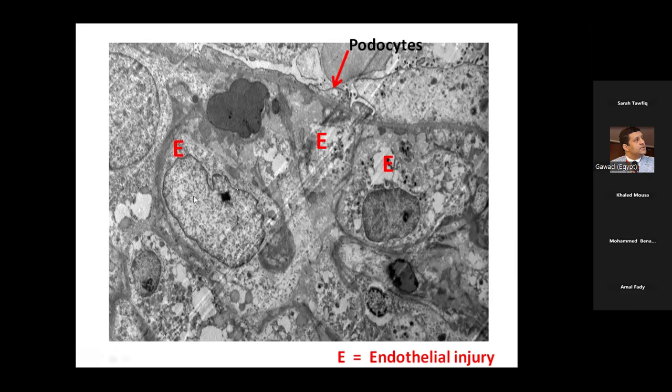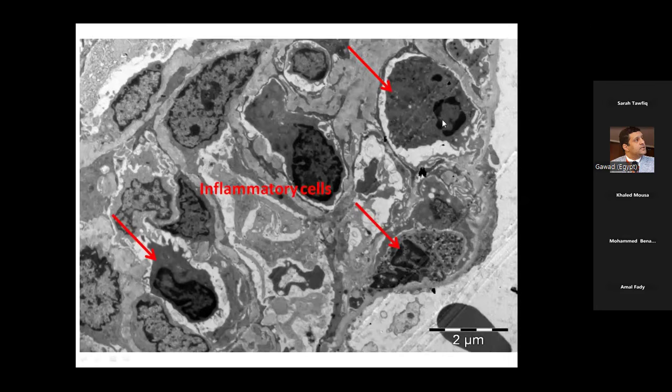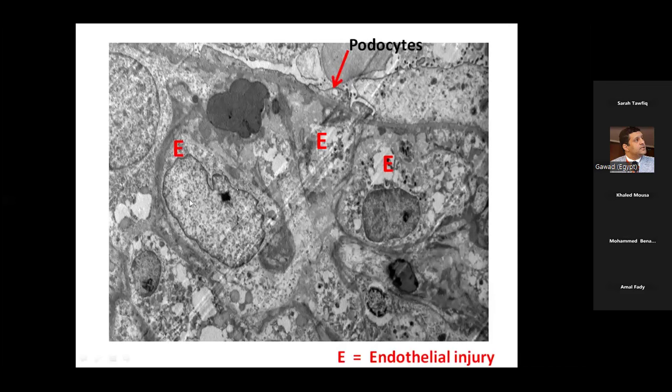The nucleus here is big and light colored. Let's compare with this. The nucleus here is small and dark colored, or segmented, of the neutrophil, very dark. Back to the endothelium, large nucleus and light colored. I think it's obvious. Yeah, right? It's clear now. I think yes, Dr. Khalid, it's clear. Yes, you can continue.